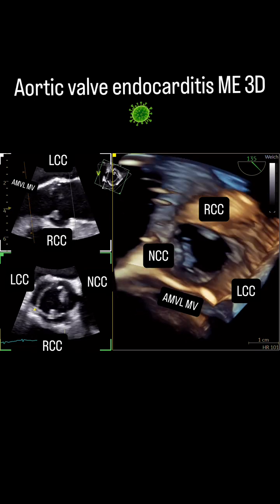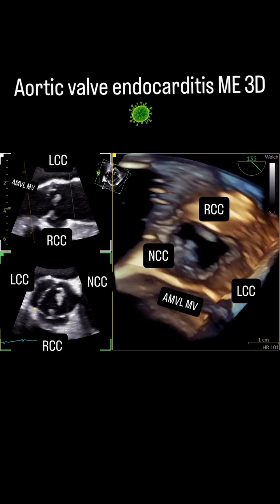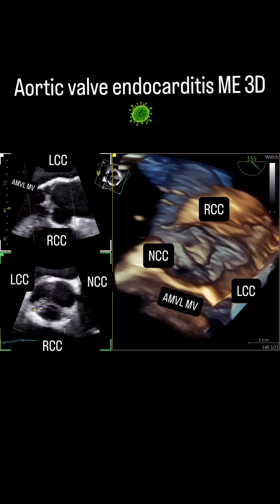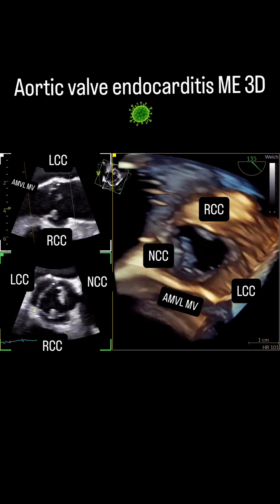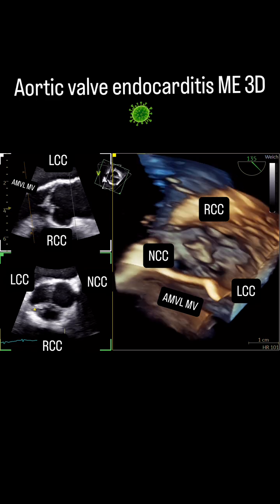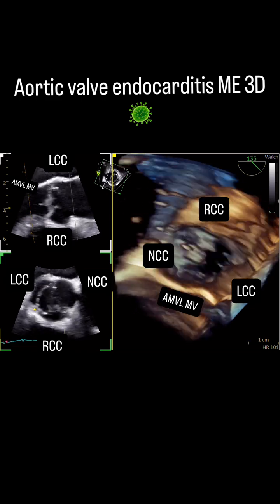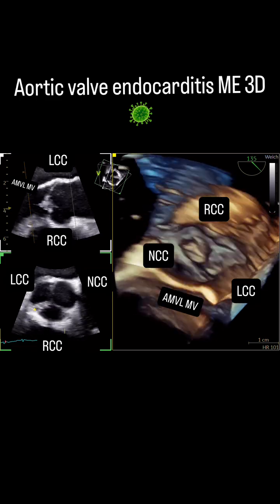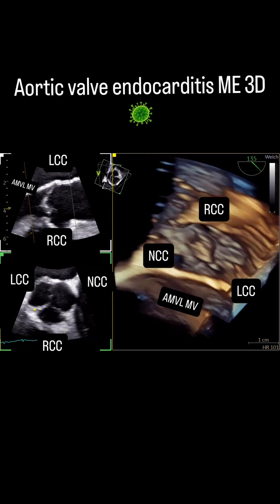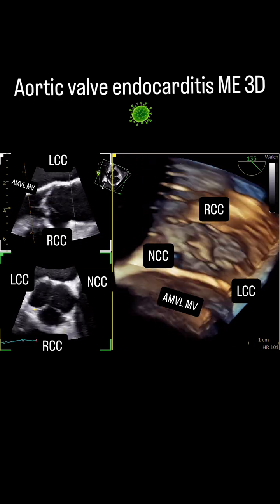3D imaging is very important, but keep in mind to understand the anatomy correctly. If you understand the anatomy, you will always be able to identify the involved cusps or the involved structures in the respective pathologies you have seen. Still use 2D imaging to optimally identify structures in 3D. We'll be right back.